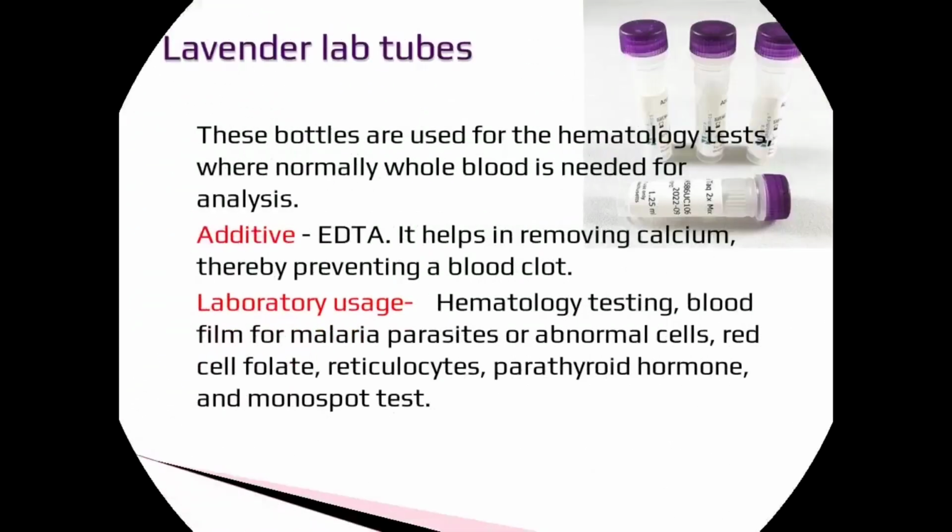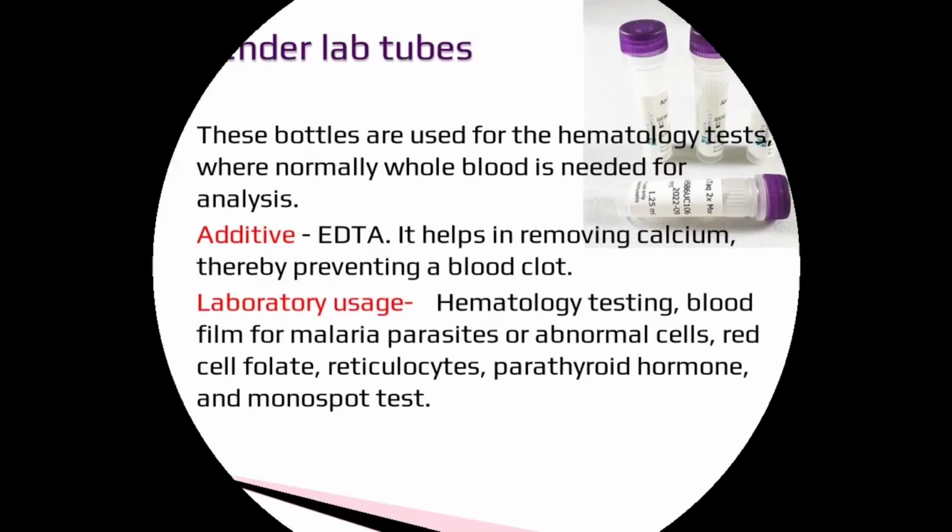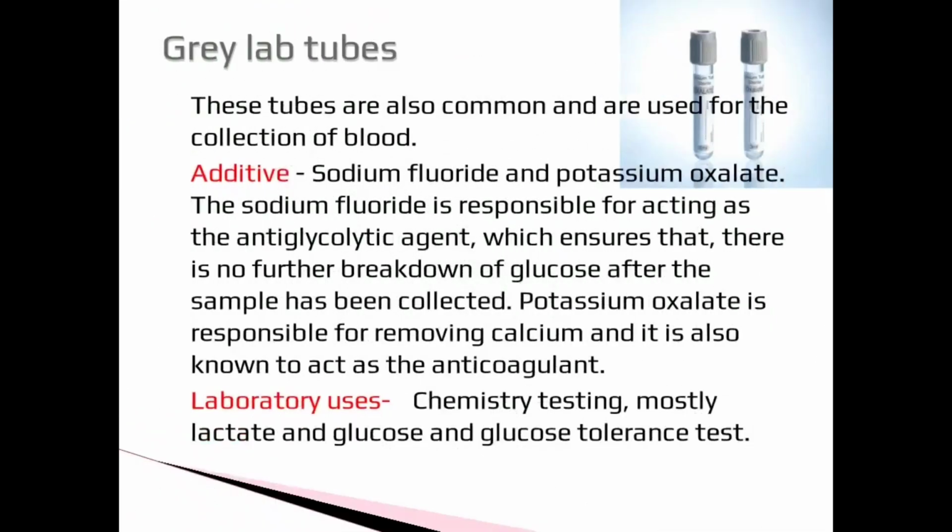Next is the lavender tubes. These bottles are used for the hematology tests where normally whole blood is needed for analysis. Commonly used additive includes EDTA. It helps in removing calcium, thereby preventing a blood clot. The tests include hematology testing, blood film for malaria, parasite, etc.